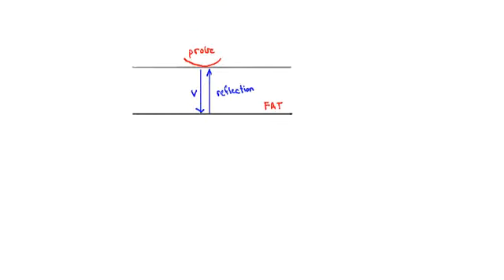So let's say it's fat above and muscle below, and I want to see where that interface is. So the reflection makes that possible. So you can know the distance down. The distance is just the speed times the time it took for the pulse to come back to the probe, divided by 2, and the 2 is because it has to go down and then back up.